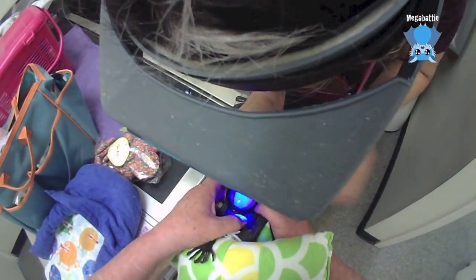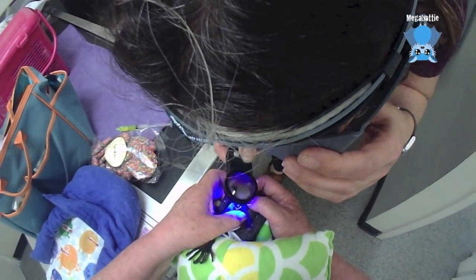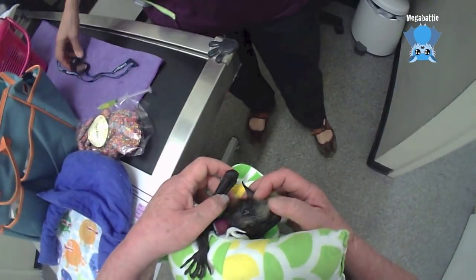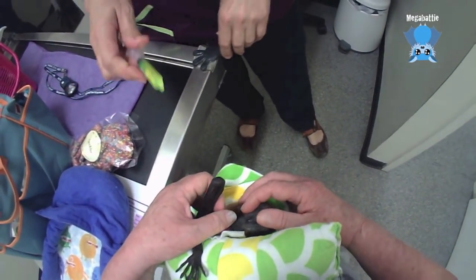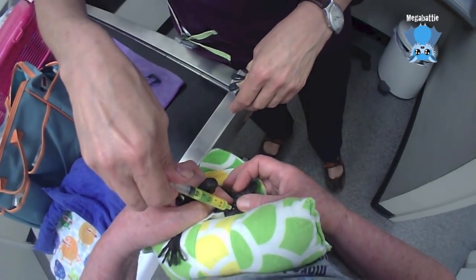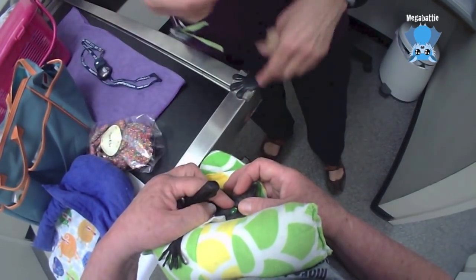There's magnification on that as well if I want to have a look. That's fine — not even a tiny, teeny tiny slide normally. We've got the stuff here — we have the technology, we have stuff left.